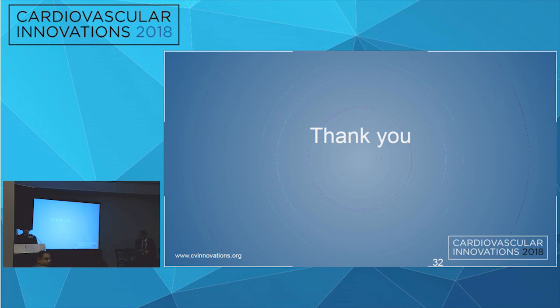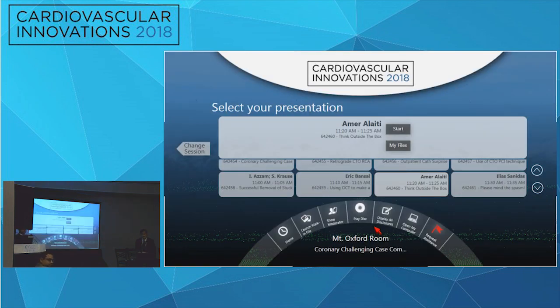One comment: as big as this artery is, it's like an SFA in the heart. There is so much twist that people have used self-expanding stents. That could be one option. You get a much bigger lumen, you can post-dilate it, and you probably have less risk of dissection and perforation at the edges. A carotid stent, I've not used it in the LAD, but I've used it a couple of times in the RCA. That might be another option.